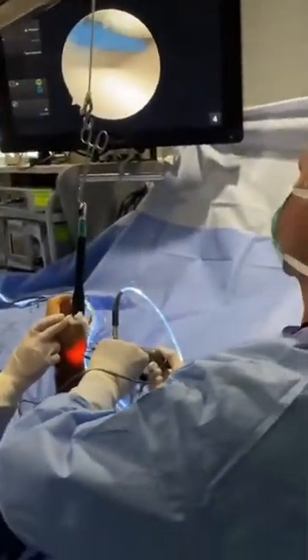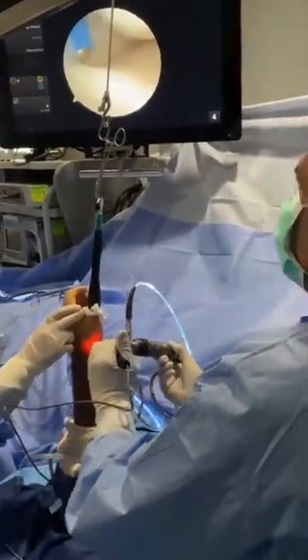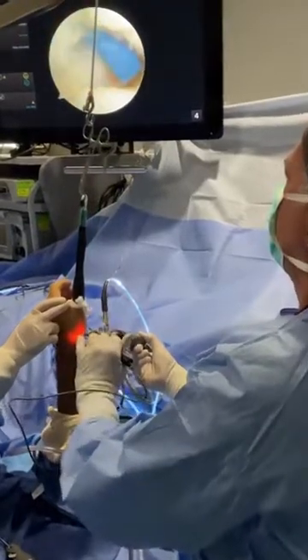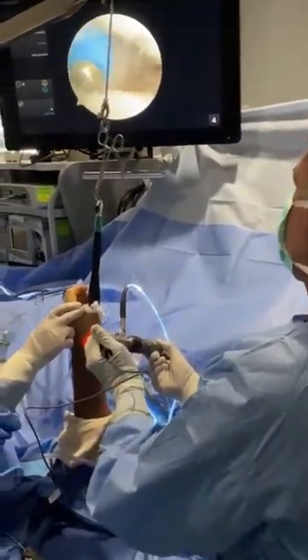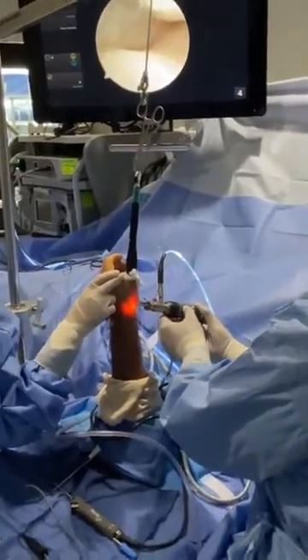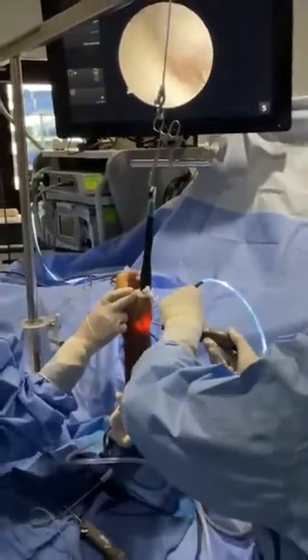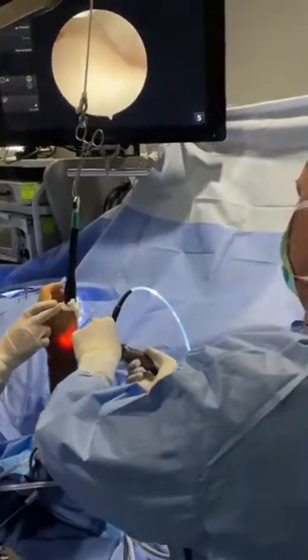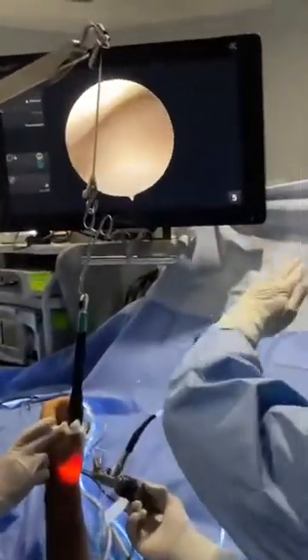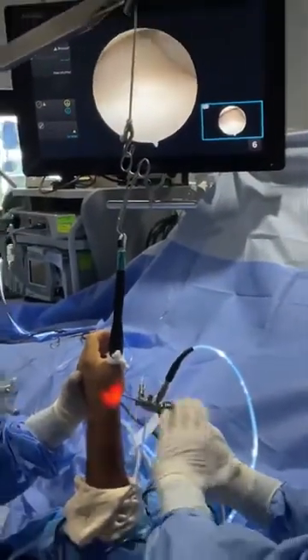There are questions in Spanish asking if this patient has a rhizarthrosis diagnosis. No — the diagnosis is persistent pain at the base of the thumb, at the trapeziometacarpal joint. It is a very important joint — think about the pinch grip. There's no rhizarthrosis, which would mean cartilage loss — but look, the cartilage looks very good. There's no more synovitis, the capsule is a little tighter, no pin is needed for immobilization. We're done.